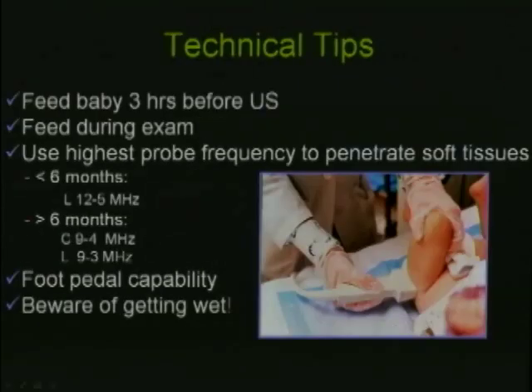Just a few technical tips before we talk about how to do the examination. We ask the parents to bring the babies after a 3-hour fast so that they will be hungry during the examination, and they can bring breast milk or formula in a bottle that they can feed the baby during the exam, so we have the best cooperation that is possible.